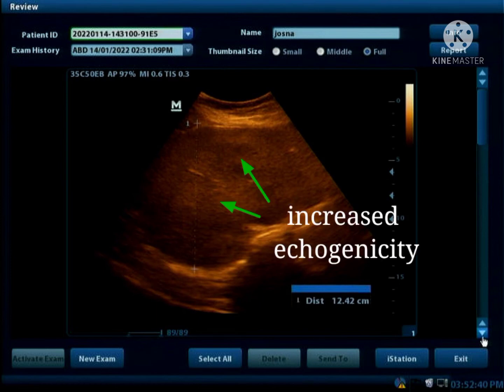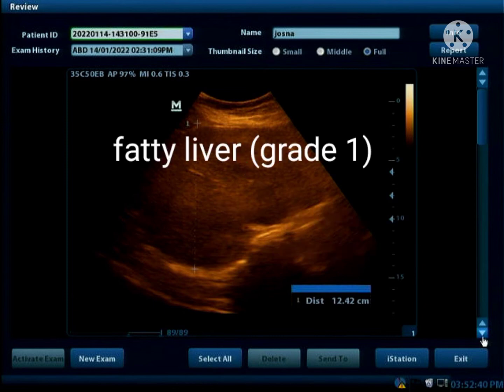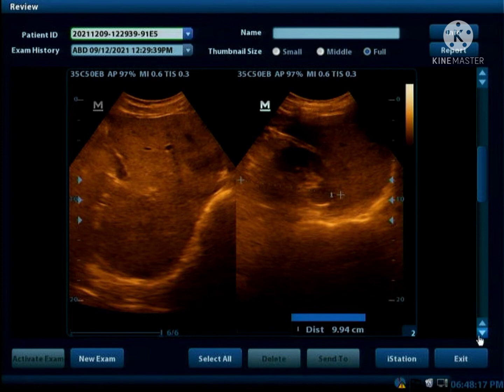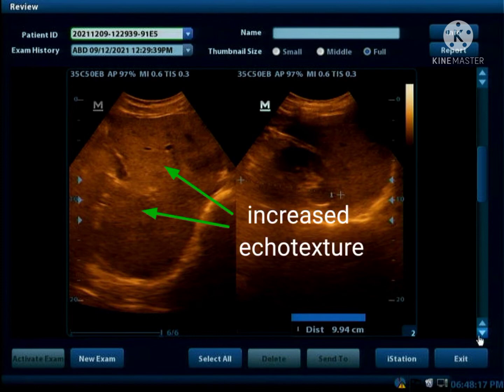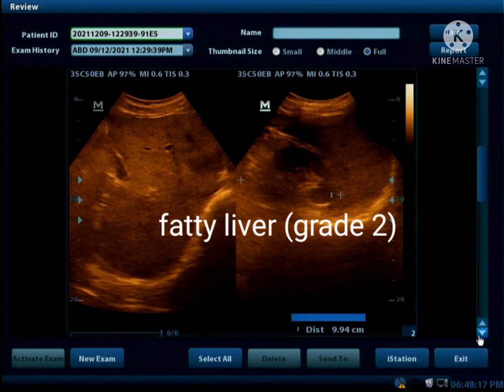Here we can see that the liver echo texture is mildly increased. Here the liver parenchyma is moderately hyperechoic and the vessels are not well visualized, so this is a Grade 2 fatty liver.